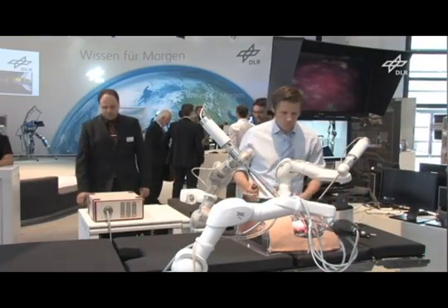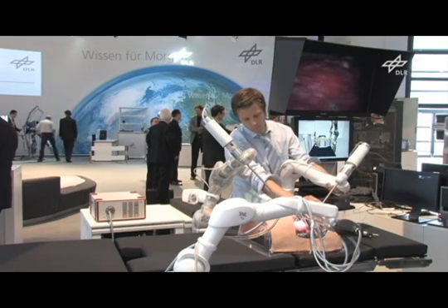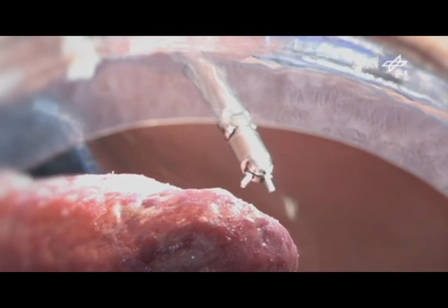The three arms you see here constitute our medical robot system MiroSurge. Torque sensors in each joint make the arms very sensitive. This enables the grabbing and moving of the robot structure, making it very easy to insert the endoscopic instruments into the patient.